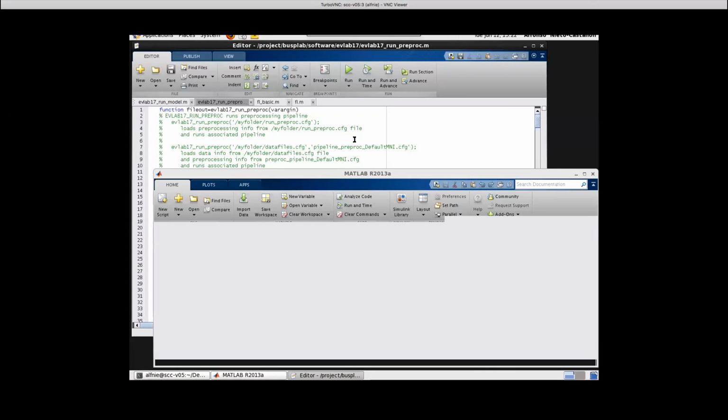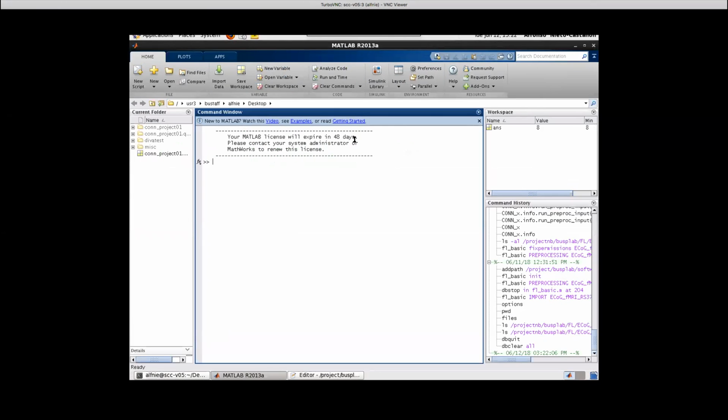When you run preprocessing pipelines, it goes into the derivatives folder, with a subfolder named for each pipeline. And when you run first level analysis, they go into the first level results, under the name of the first level analysis. So only the first level analysis goes into the derivatives MNI space subject folder? Preprocessing would go into where?